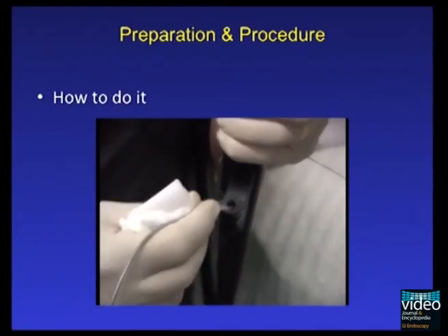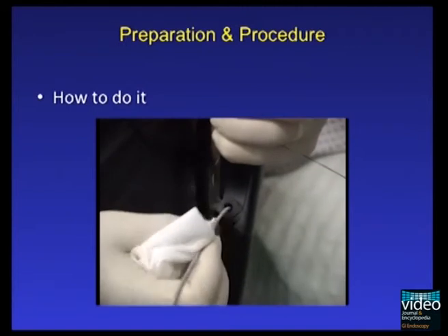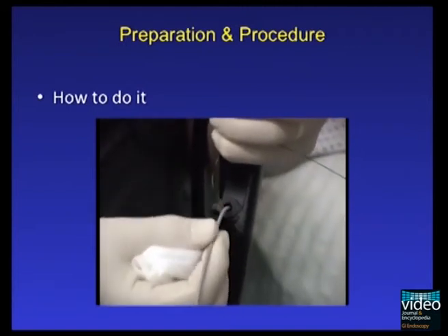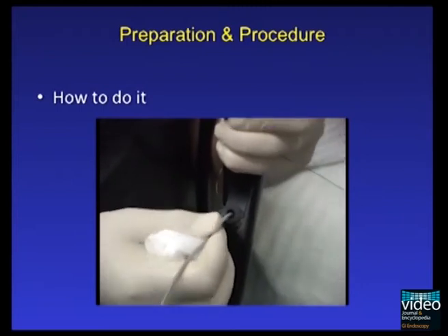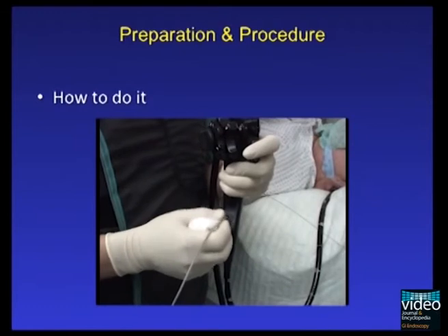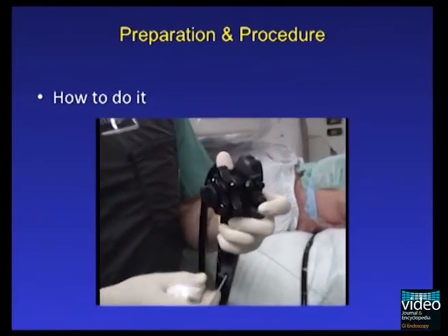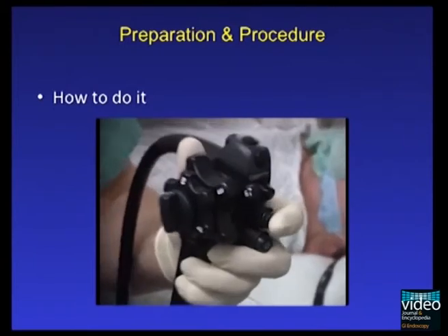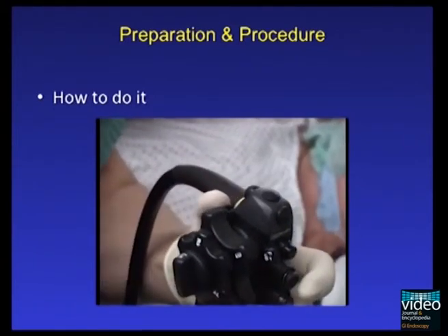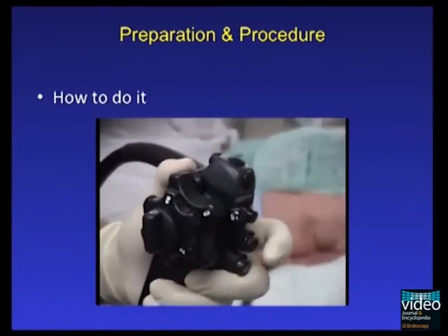The mini-probe is carefully inserted through the working channel of the duodenoscope. Due to the fragility of the probes, it is essential to move the catheter in short movements. The mini-probe is advanced until it reaches the tip of the endoscope, during which the elevator is in the closed position.